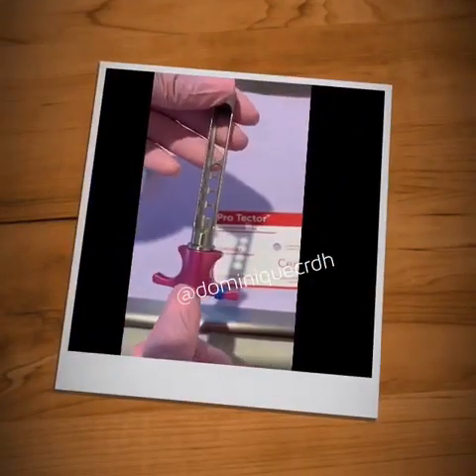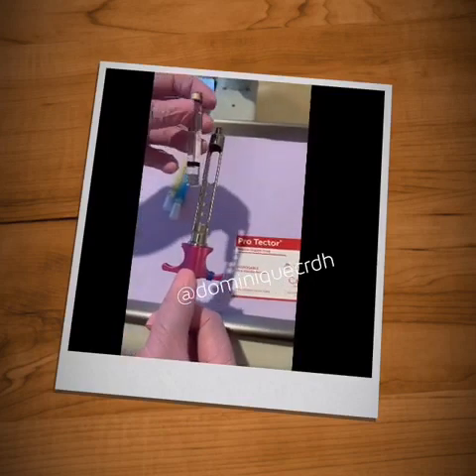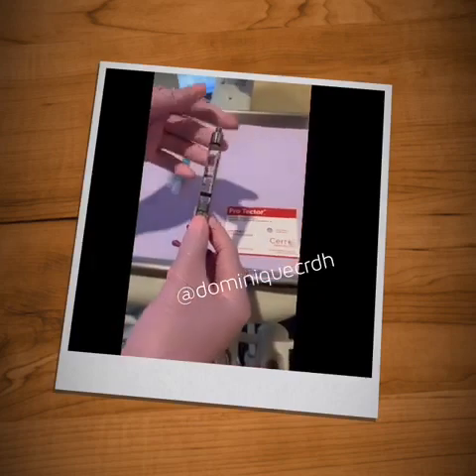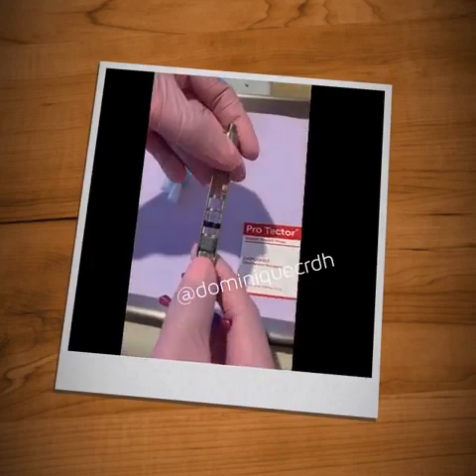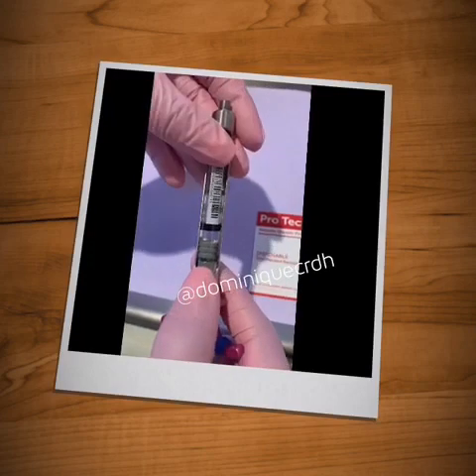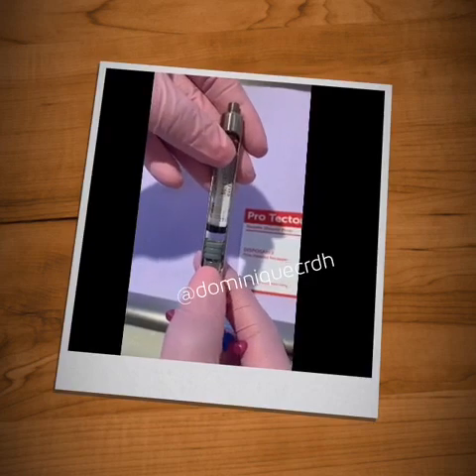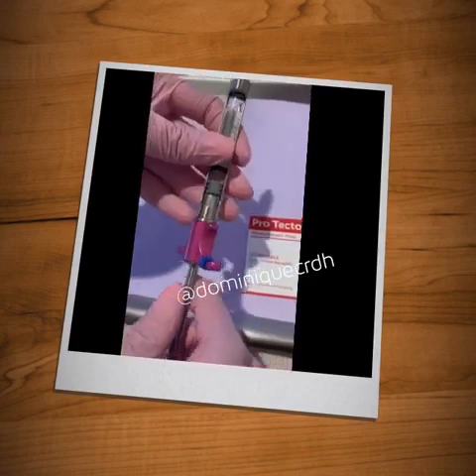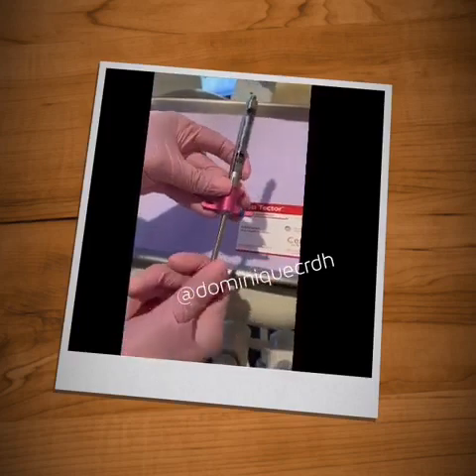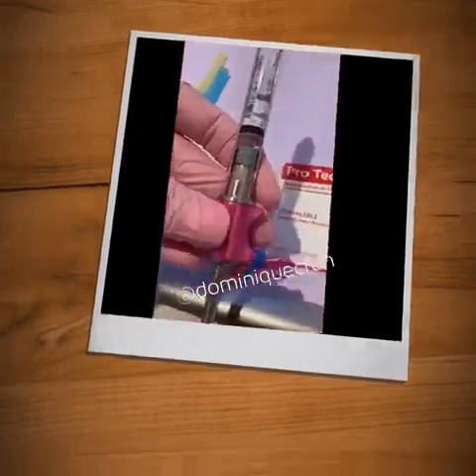Okay, we are ready to load the syringe, and I start first with taking the carpule of anesthetic and placing it into the syringe barrel. As you are doing so, you want to make sure that the serial number is not blocking your view as you are looking through the window. One important step as you are administering painless anesthesia is to be able to see the rubber stopper as you are depositing the medication, so you want to make sure that the view is clear. Next, I push onto the harpoon to make sure that the piston is stuck into the rubber stopper, and you can use the finger grip to accomplish this.